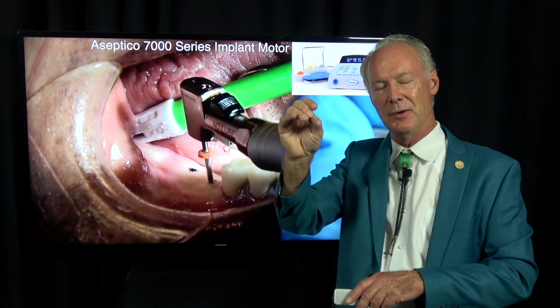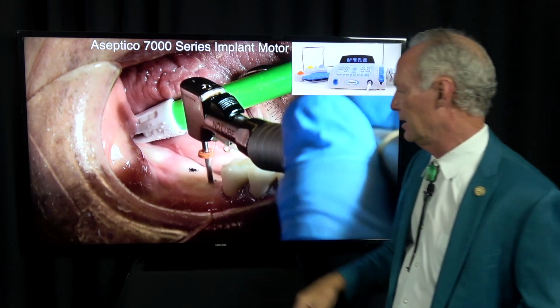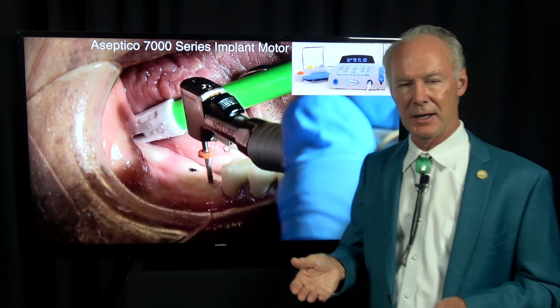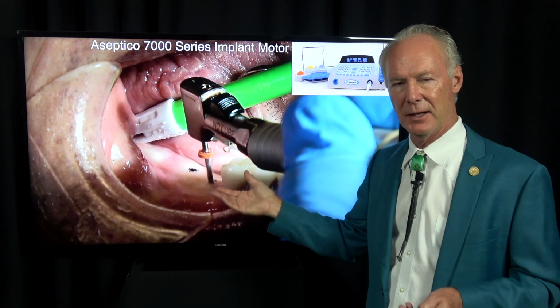That's 15.85, that's 16. So I'm safe drilling to 14 millimeters because a periapical radiograph is 1:1. Now you could not measure that on a panoramic. If you want to be triple safe, you could have a cone beam and you could use a pilot drill.